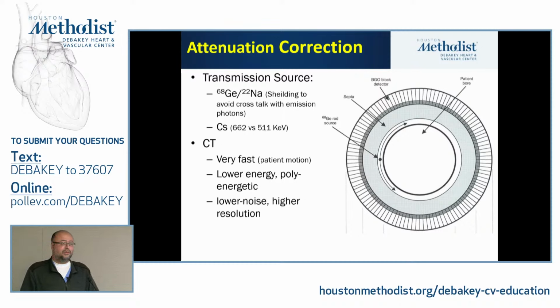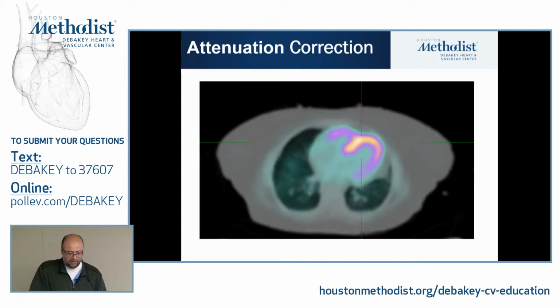Most of the PET machines now, if you want to buy a new one, you go to any company, they don't have anything except PET CT. And some of them will have a PET-MR machine, which is still growing. It's still a promise. We're still trying to find out where it's helpful. The PET-MR machine uses the MRI for attenuation correction. This is still going to be a challenge in cardiac, and it's not widely utilized for that. Okay, so this is how you do it.